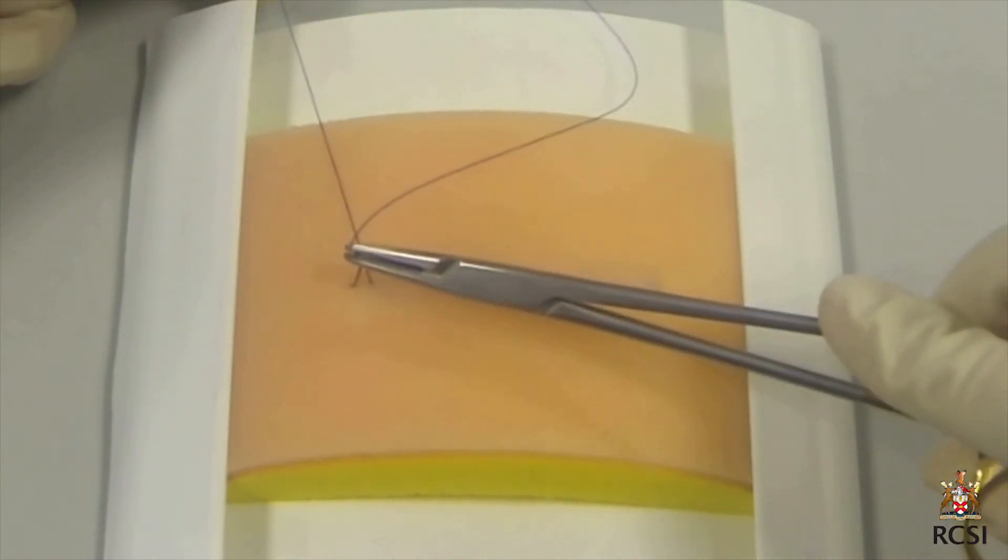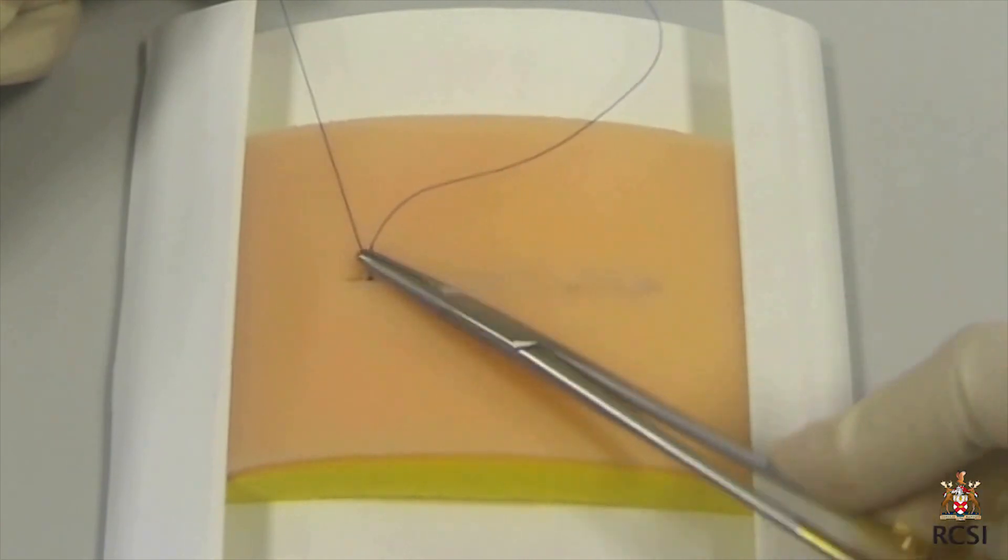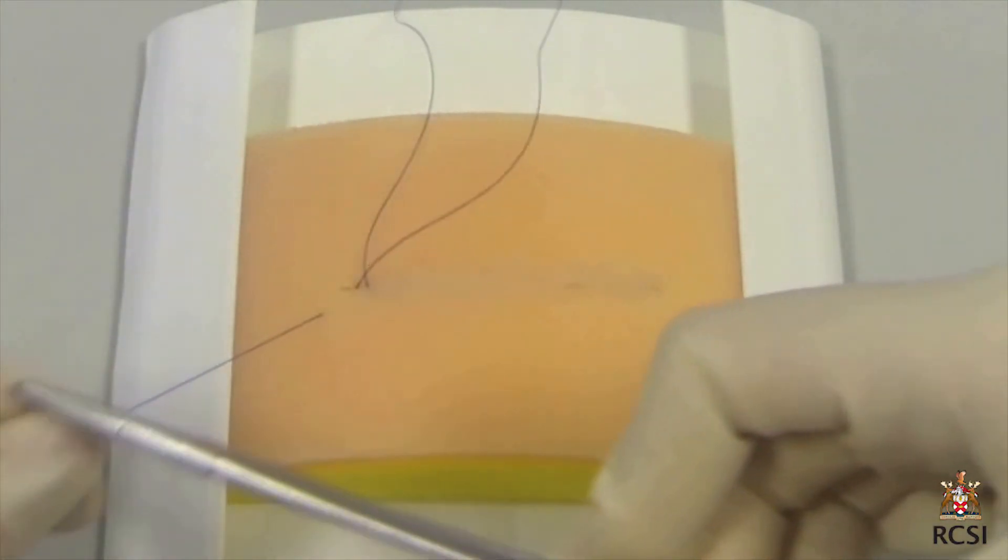After tightening 3 loops, the long end of the suture with the needle attached is pulled through the loop entirely and it is tightened. To bury this knot further, the needle is reinserted deeply away from the apex of the wound. Where the needle exits through the skin, the suture material is cut flush with the skin.